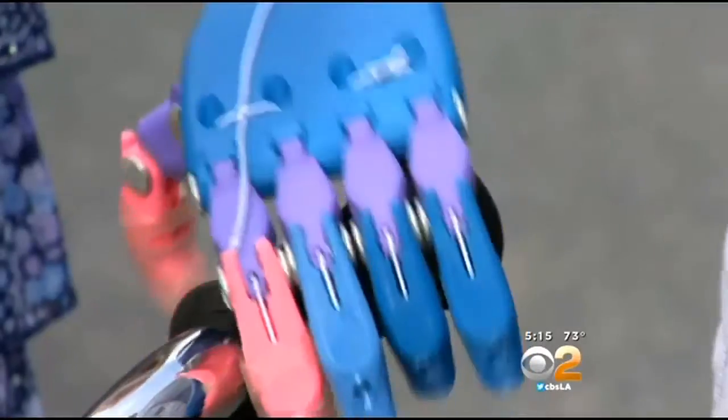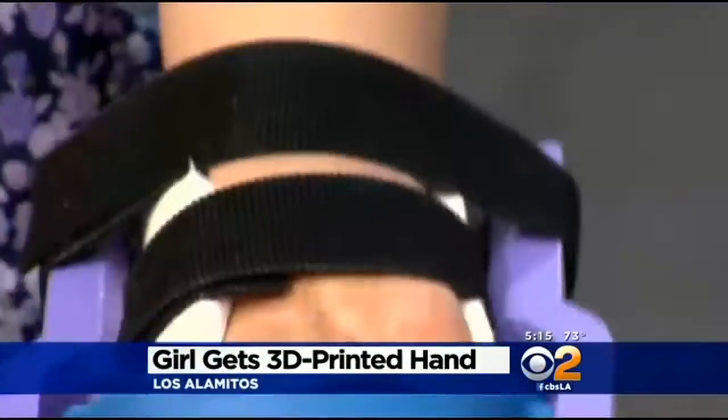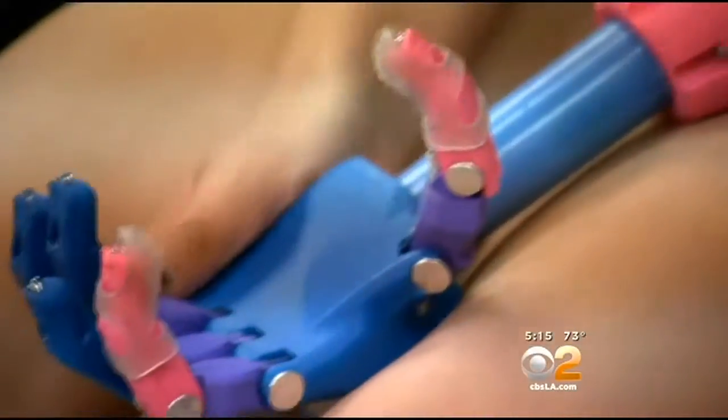Seven-year-old Faith Lennox makes using a 3D-printed hand look as easy as riding a bike. The first grader's favorite part of her new left hand? "I like the colors." She chose them: pink, purple, and blue.